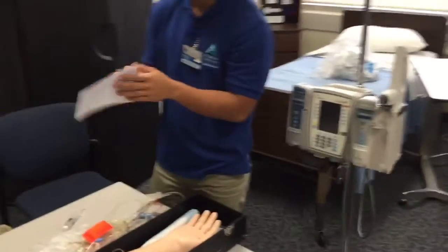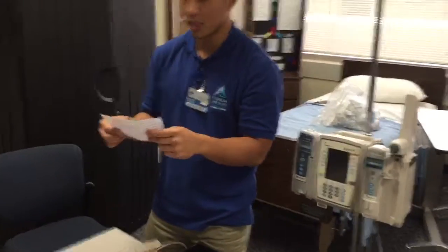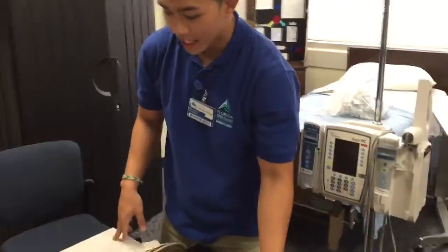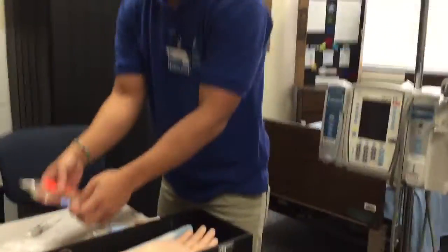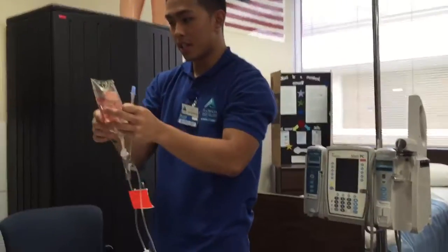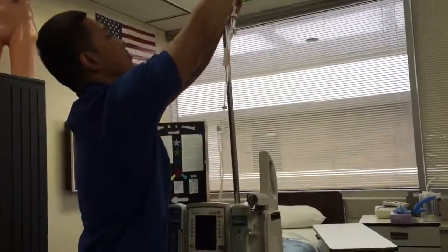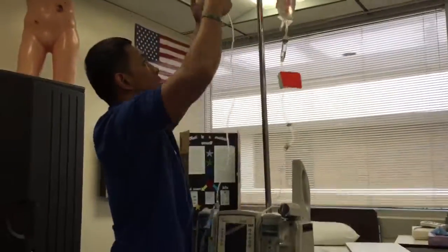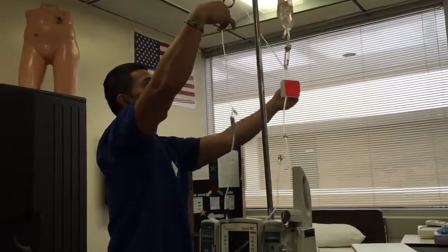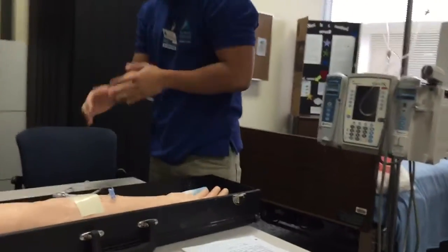I'm going to go ahead and check the doctor's order and the MAR once again, just to make sure it matches the patient. I'm going to explain the procedure, which is that we're going to be hanging a mini bag for you, and it has Flagyl, which is an antibiotic. It was ordered by the doctor, so that's good. I'm just going to go ahead and put this up here for now. And before I do anything else, I'm going to go ahead and wash my hands, perform hand hygiene, and put on my gloves.